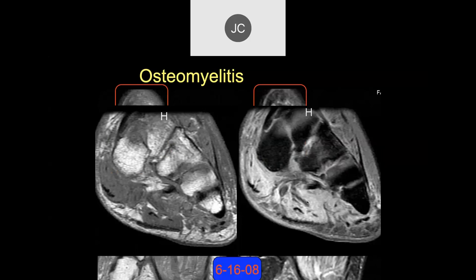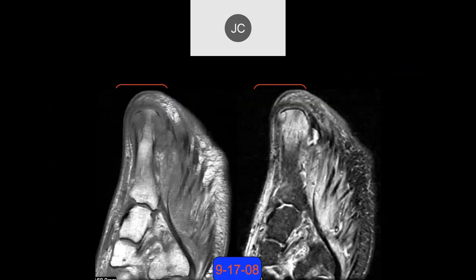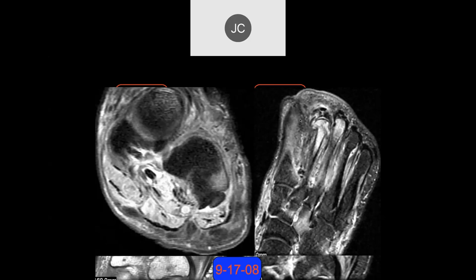The patient comes back about three months later in September 2008. They've had an amputation of the distal great toe, but there's a lot of edema in the first metatarsal head, and in the second and third as well, more proximally.